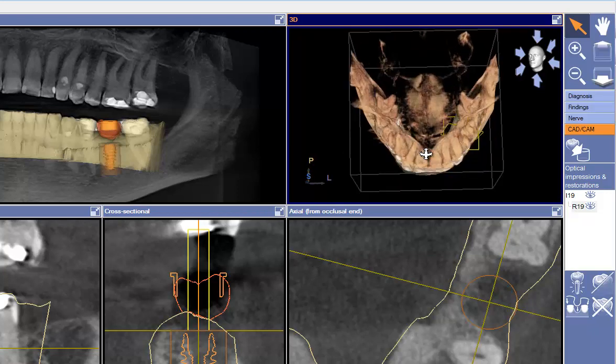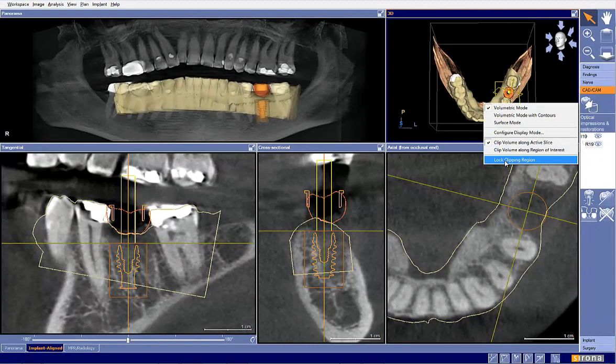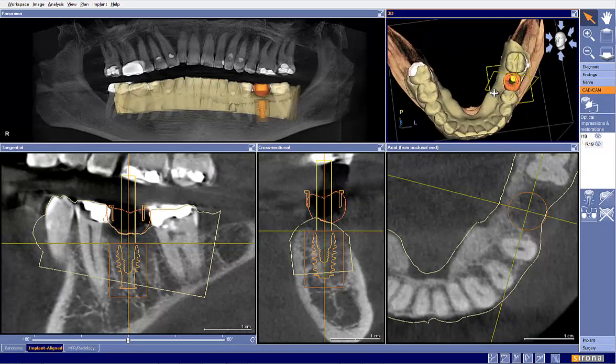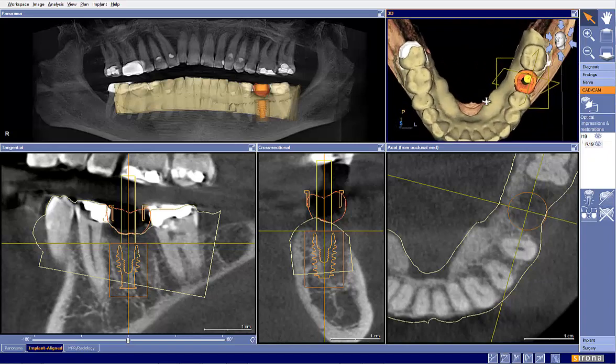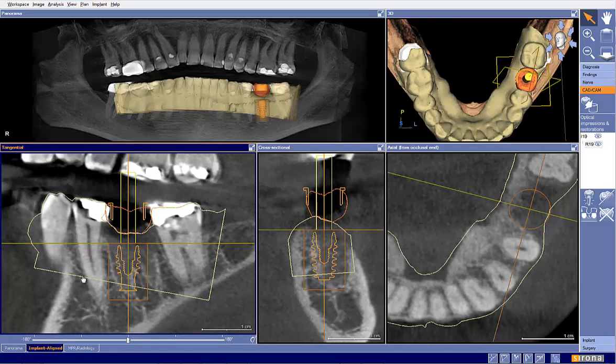What I also like to do in this situation is go ahead and right click in the 3D skull view and click along active slice, and then I go ahead and lock that in place, so that way as we're looking we can look down and see how everything looks here. So let's go ahead and take a peek. And mesiodistally, I'd say we look pretty good. Certainly we have enough room. If anything, I would say we have a lot more space to the distal versus the mesial, but that just may be how this site works out. Buccolingually, very nicely placed here.